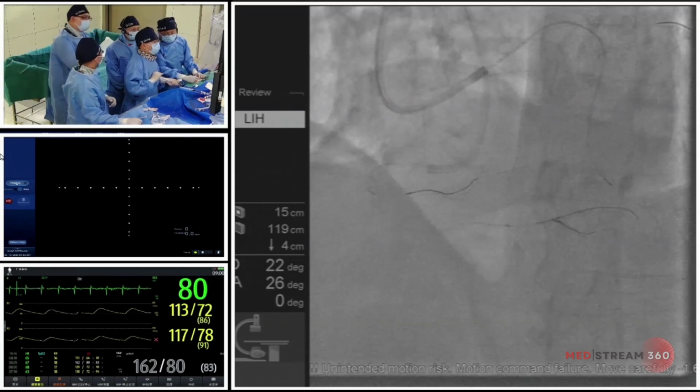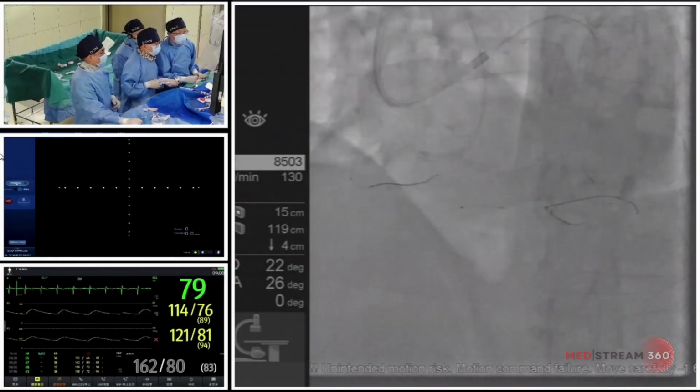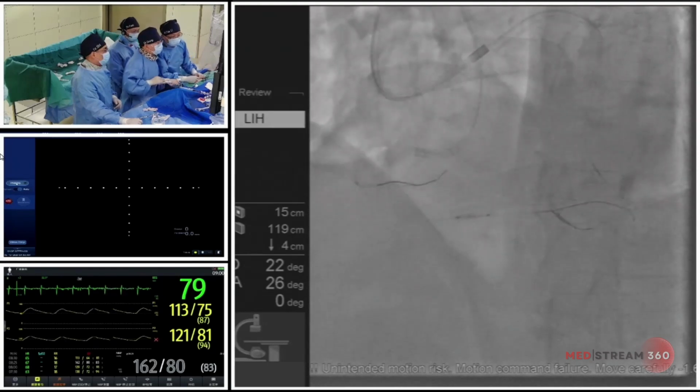Okay, so I think, thank you. This is a great accomplishment. So Professor Lee, we are still online. Dr. Mehta wants to see us finish this case. I think this is a great accomplishment. Thank you. And we are still working on the case.